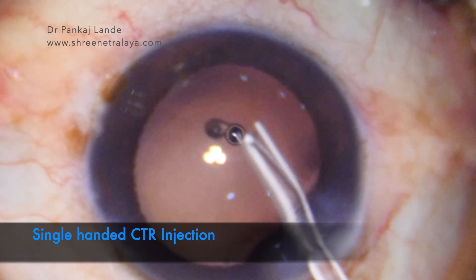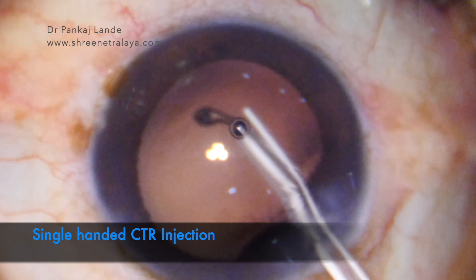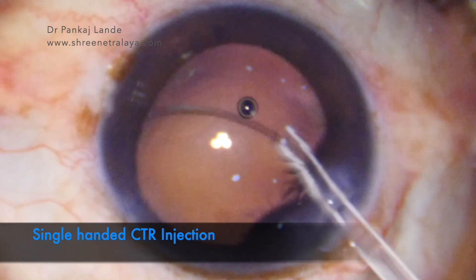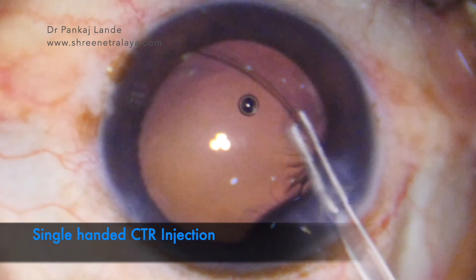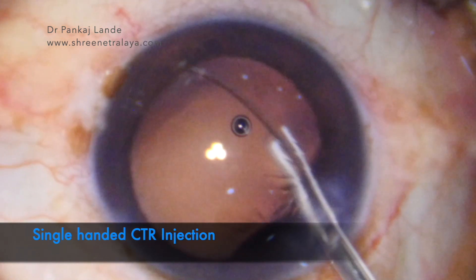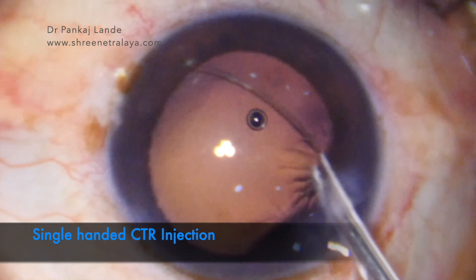Capsular tension ring is an important device used in cases of zonular dialysis, pseudo-exfoliation, pediatric cataracts. It also helps in cases of high myopia, high hyperopia, small rhexis cases where you expect capsular phimosis to happen at a later date, post-uveitic cataract, and post-traumatic cataracts.